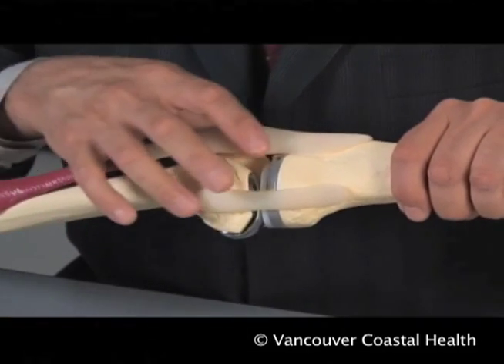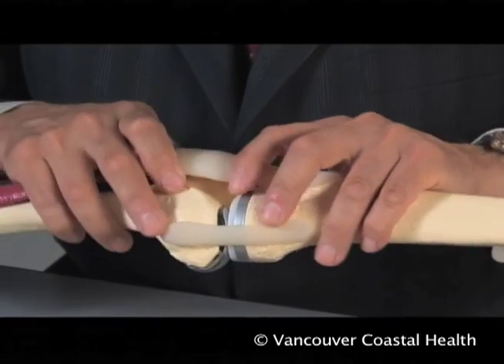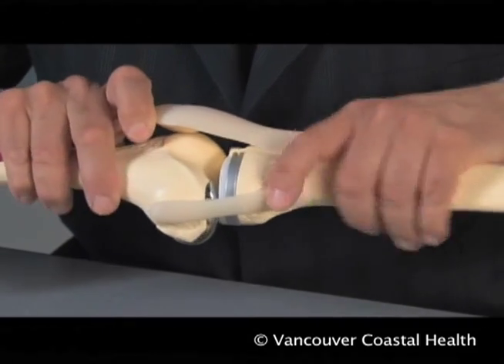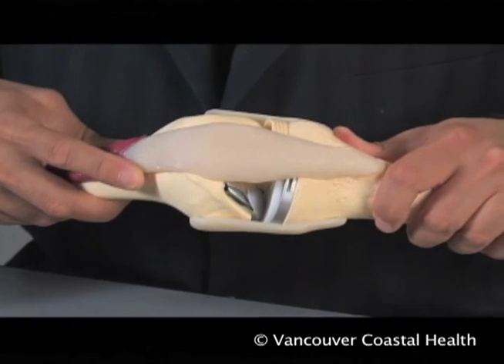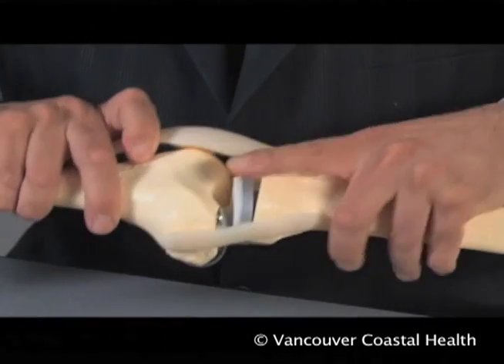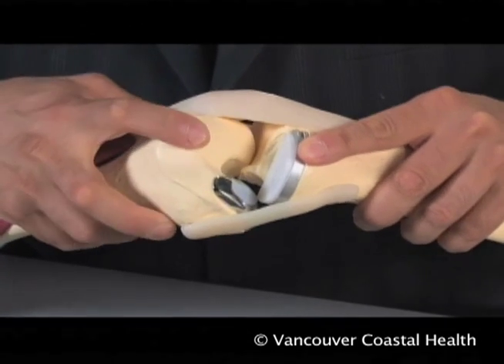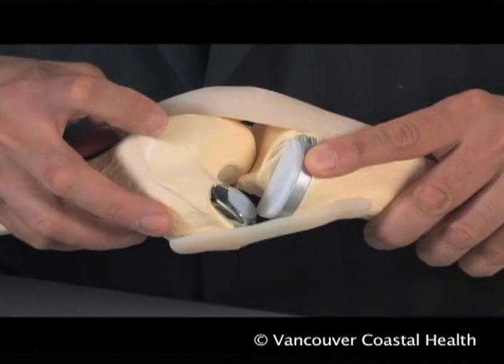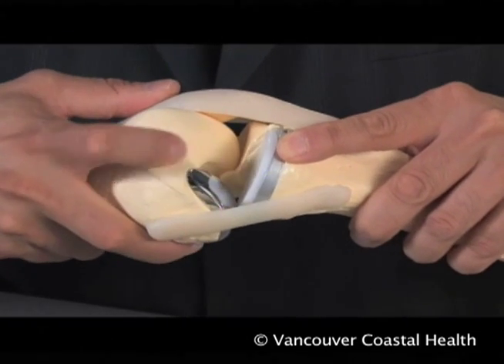You can also have a partial knee replacement, which is done through a similar approach, except the incision does not extend as far up. The patella is shifted out of the way slightly to allow the surgeon to put in the components of the partial knee replacement, as you can see here. Opening up a little more, you can see that one part of the joint is completely normal and not operated on, and the other part is operated on.